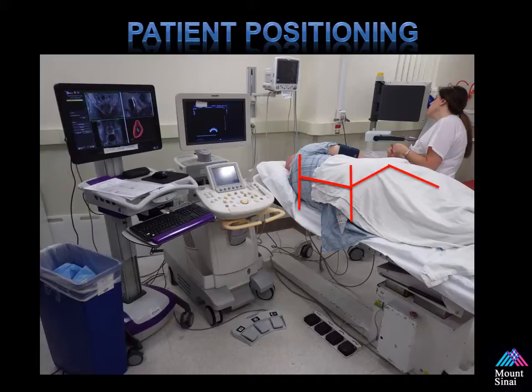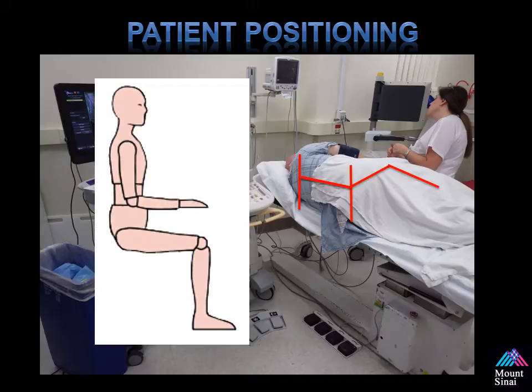Notice the machines. The first is the ultrasound machine, which is next to the patient. I typically place it here because I use the high resolution ultrasound also to evaluate the prostate during the procedure, and my technician works on the left, which is the UroNav device seen here. Here's just another example of the correct orientation for the biopsy. It's always important to square the patient up: shoulders, hips, and knees.